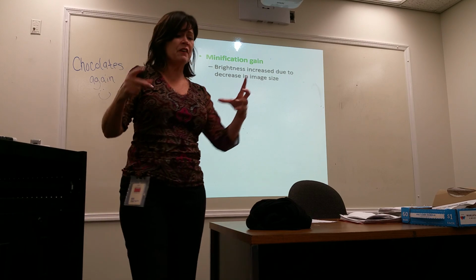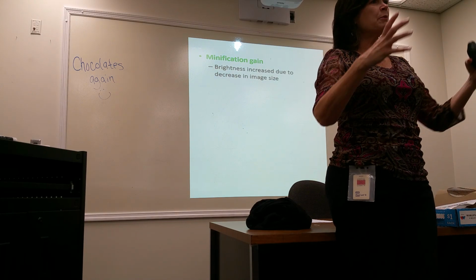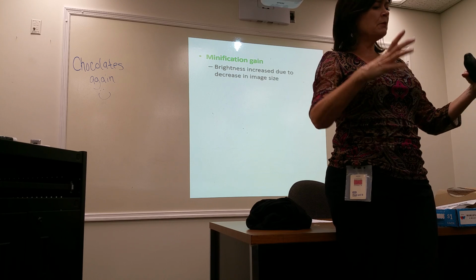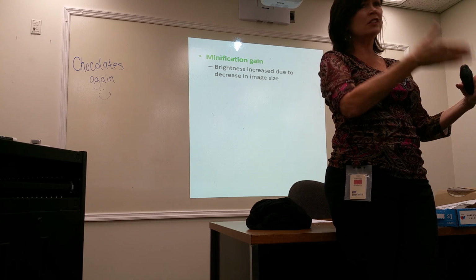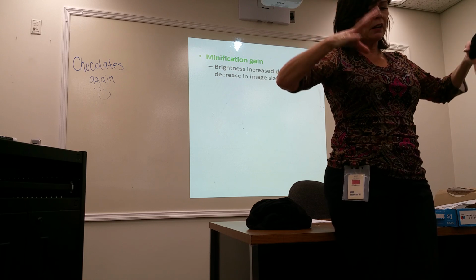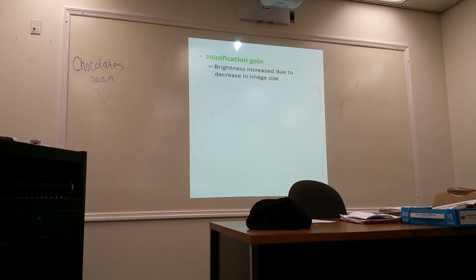Now I talked about the input phosphor being 12 inches. II tubes have the capability of having a 12-inch input phosphor. So the bottom of it is 12 inches in diameter, but that physically doesn't change, but we can make it act like a 9-inch and a 6-inch. Okay, there's not an iris where the input phosphor changes sizes with the push of a button.